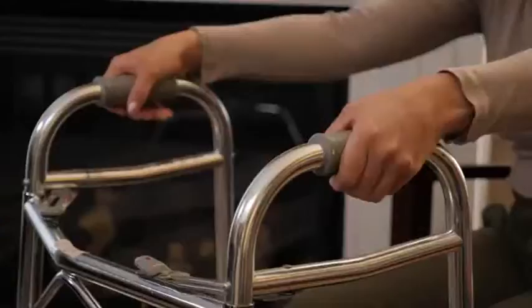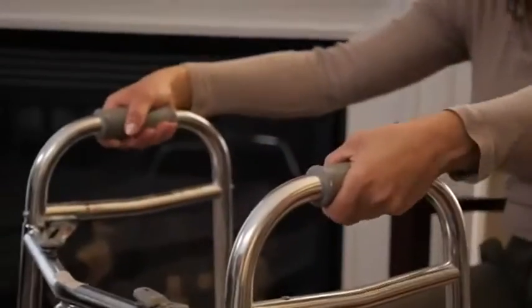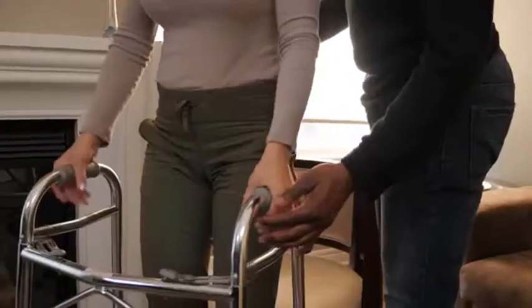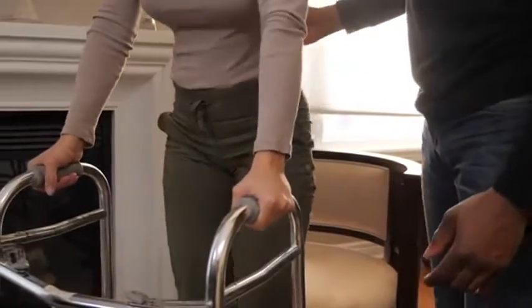If the person you're caring for is sitting, remind them not to use the walker to pull themselves up. Pulling on the walker to stand can make the walker lift off the ground and can cause a fall. Instead, encourage the person you're caring for to use a chair with armrests and use the armrests for support to stand up.